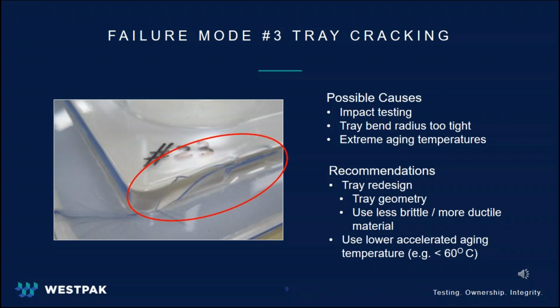As you can see in the picture here, the tray is cracked and is obvious even before you start the gross leak test. If you have this issue, we recommend redesigning the tray with the help of your vendor. They can make recommendations on the proper design of the tray and suggest materials that would be less brittle and more ductile. Make sure to check with your vendor on the optimum material to use. It may cost a bit more upfront to have a proper tray design, but you will save money in the long run with fewer failures and redesigns.